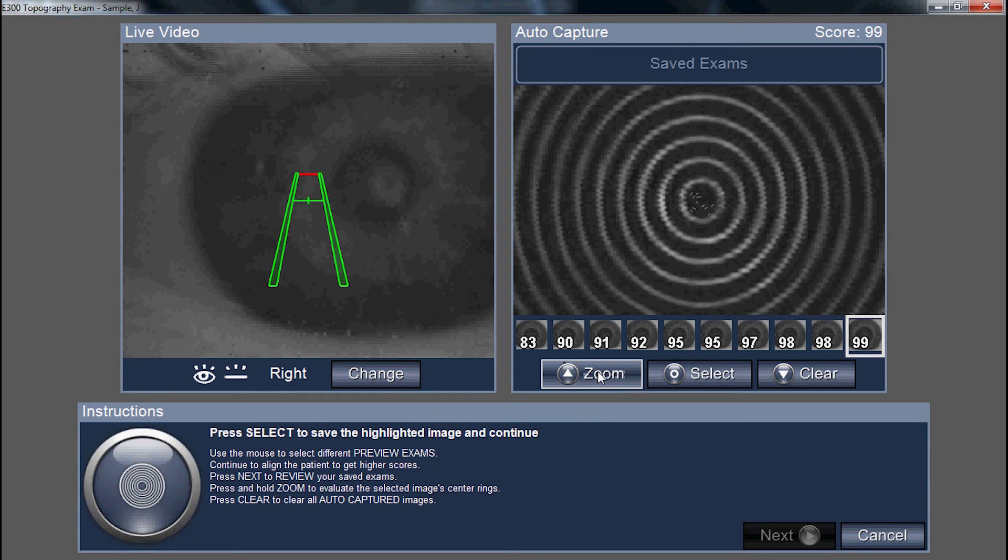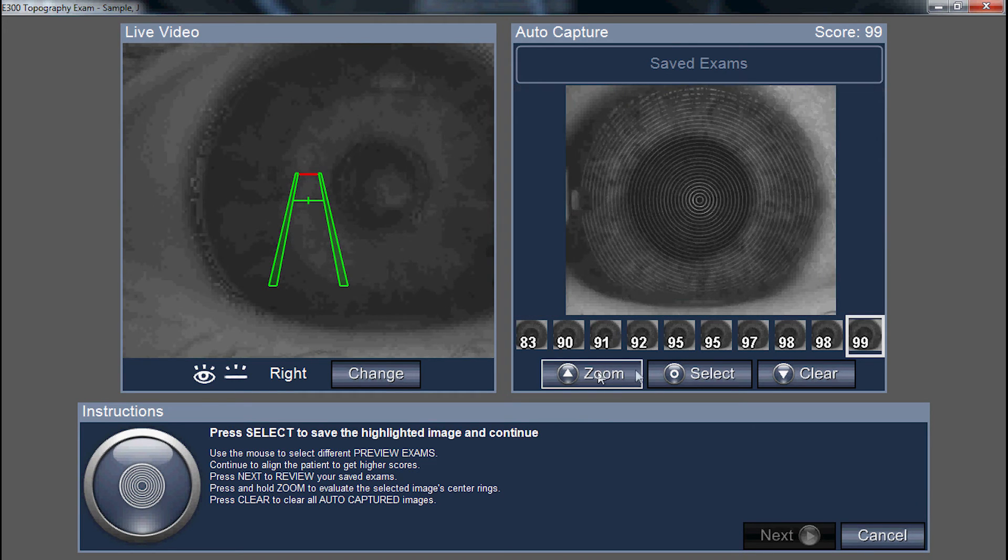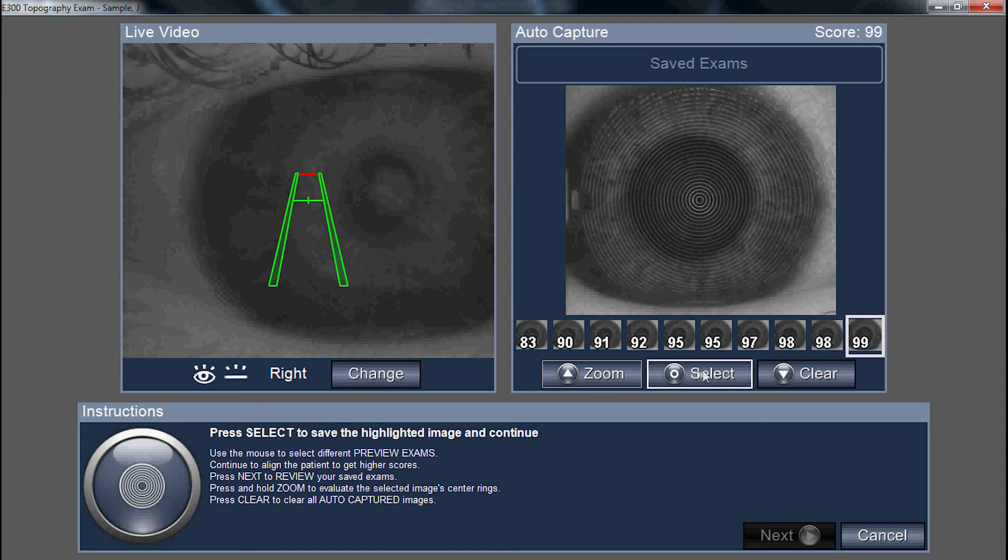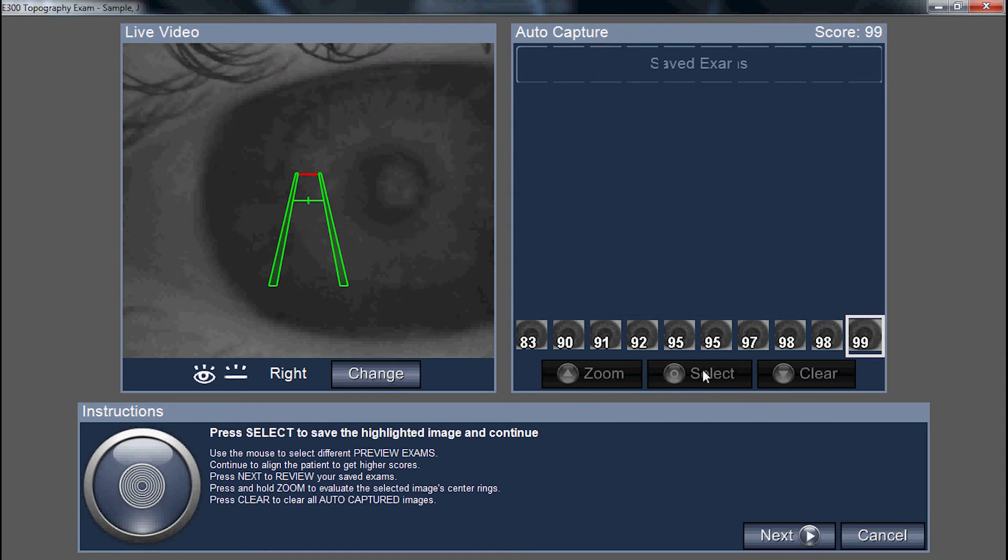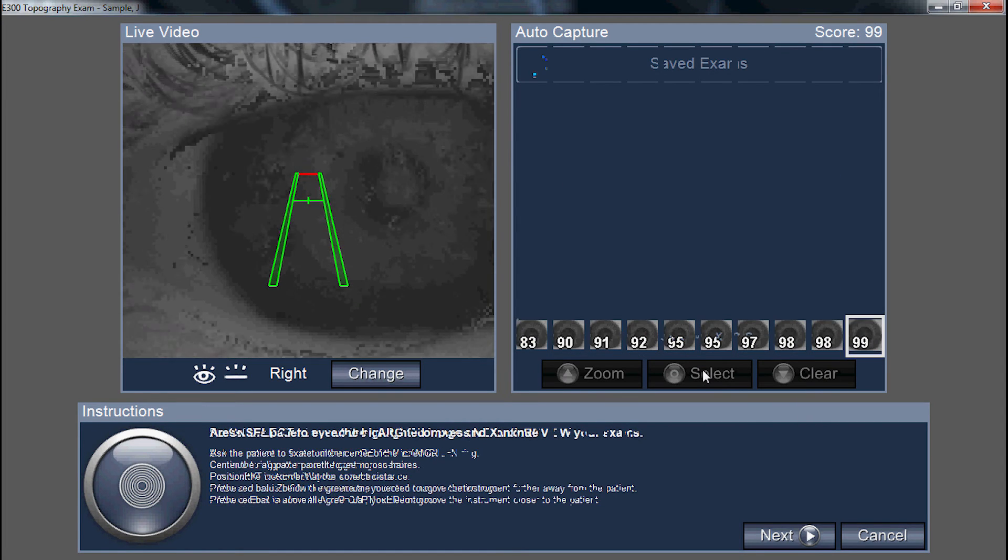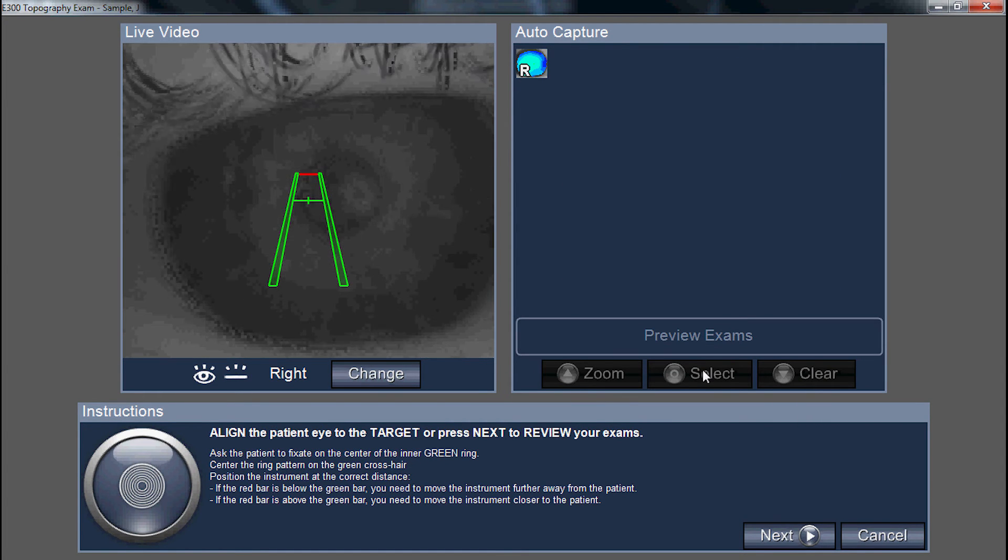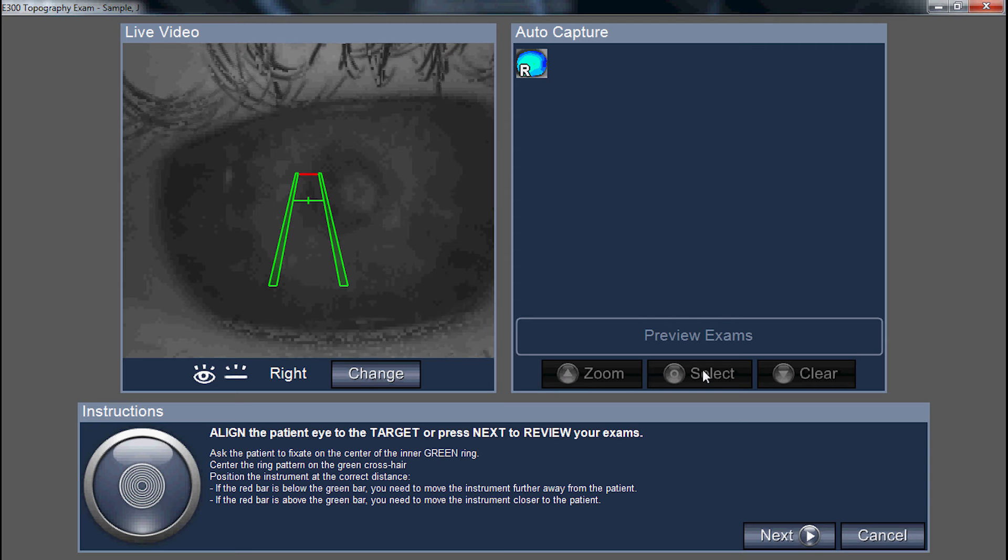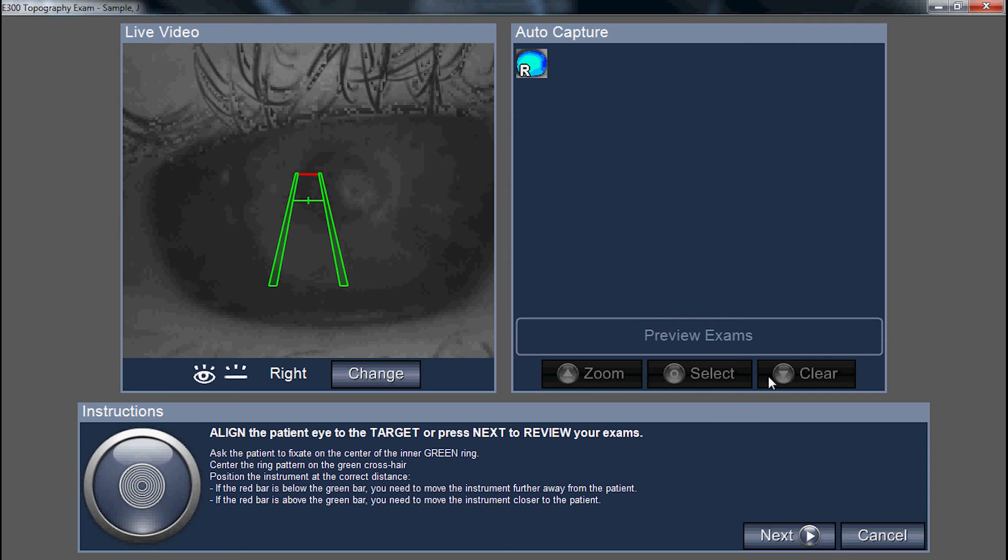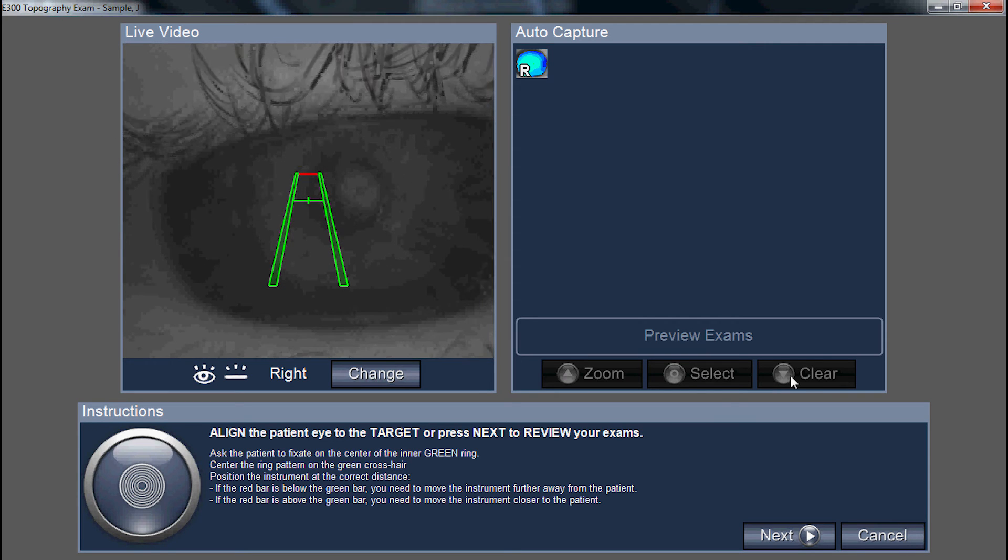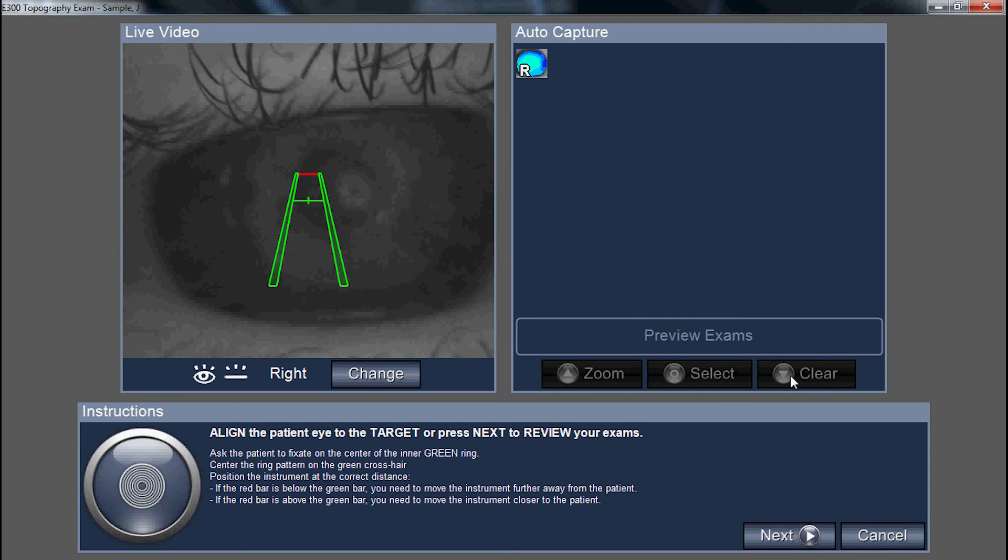If you're happy with your capture, you can click select. If you want to take additional right eyes, you can click the clear button or just continue.